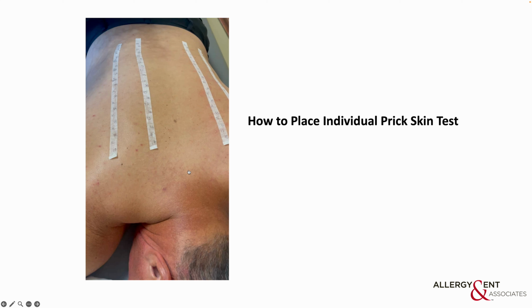Okay, so let's talk about how to place individual prick skin tests, and I'll let you watch the video in a little bit. When we place a test, this is what we call T1. You want to make sure to get enough liquid in the well of the tray so that you can transfer to the patient's skin test correctly. If the tray does not have enough liquid, you need to make sure to fill it.